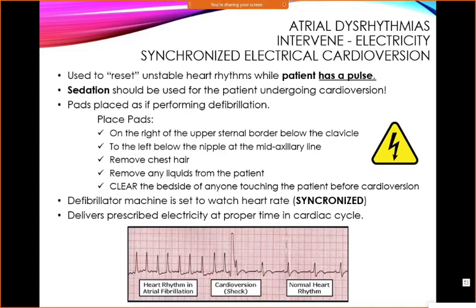Patient should be sedated. You're about to shock them. It hurts. Being shocked hurts. If you're pulsed and you have a rapid heart rate anyway, and you're a little short of breath and you're feeling symptomatic, the last thing you need is them to be like, oh, we're going to shock you, and it hurts. So we can sometimes give sedation to these patients just because we're about to shock them with quite a bit of electricity, and it does hurt.